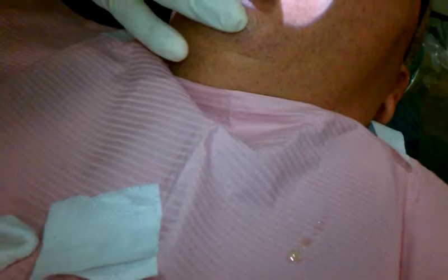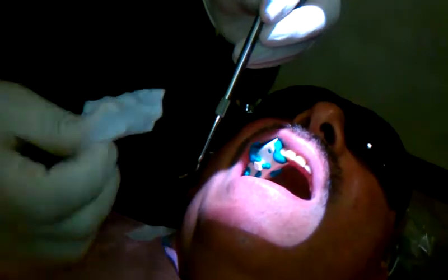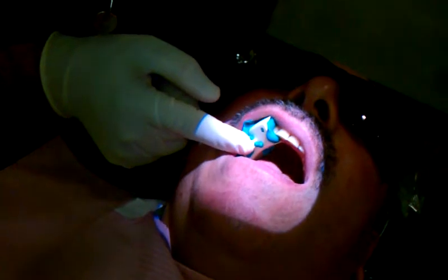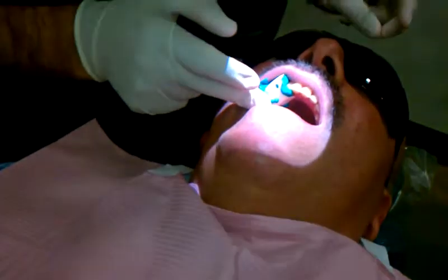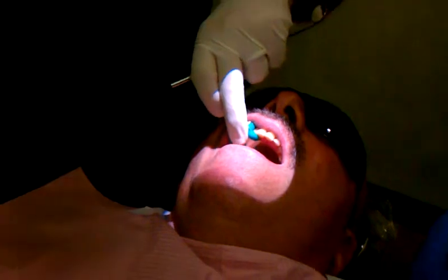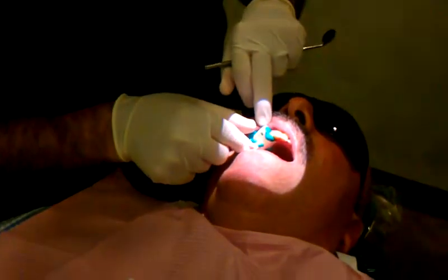It usually takes about 2 to 3 minutes. I want to make sure there is no access into the patient's throat. It's always good to have a cooperative patient. And I keep checking here — it's getting harder. So I'm going to wait another minute.